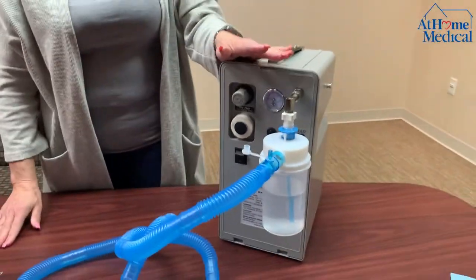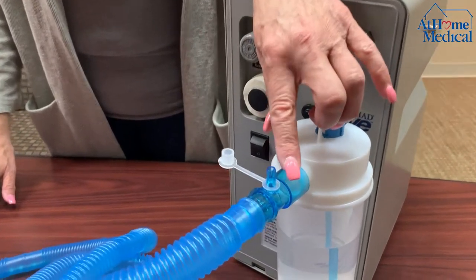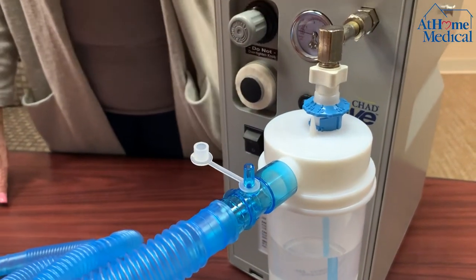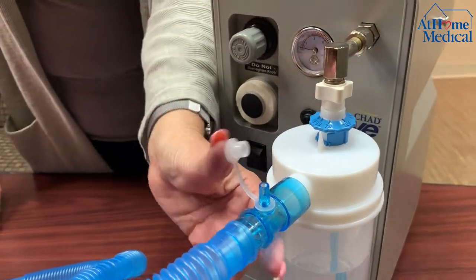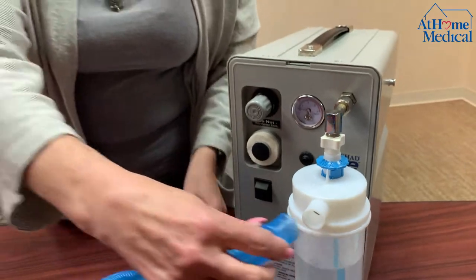If you have oxygen in the home, you would have a concentrator plugged into the wall. You would put the tubing from the concentrator to the port here to provide oxygenation. If you're not using oxygen, we usually don't use this piece, so we're just going to take it out for now.